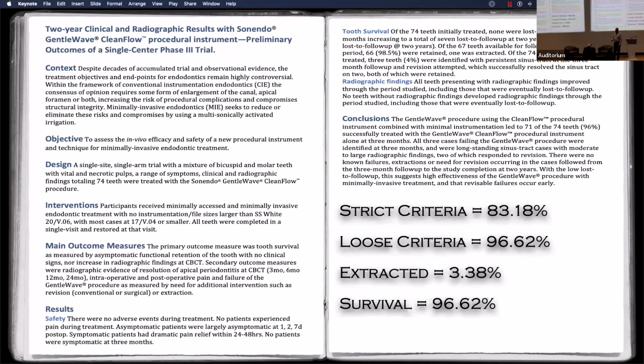I finally broke my first one either last week or the week before on a retreatment case where I'm spinning it at thousands of RPMs, melting out the gutta percha, and pushing on it in the tooth. Of course, it broke off in the gutta percha, so it was really easy to bypass. It was a straight taper FlowLogic Assert or Agile, one of those two, a fairly small file, like a 10 or a 20, probably pushing on it.